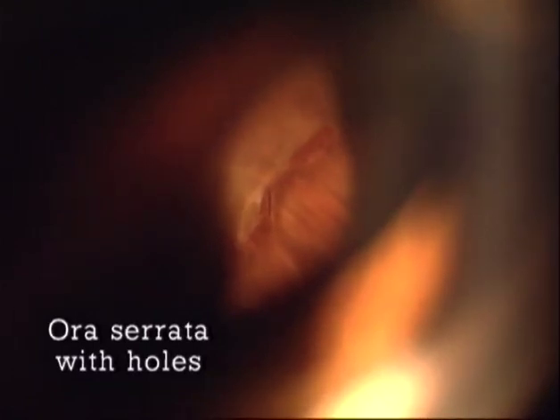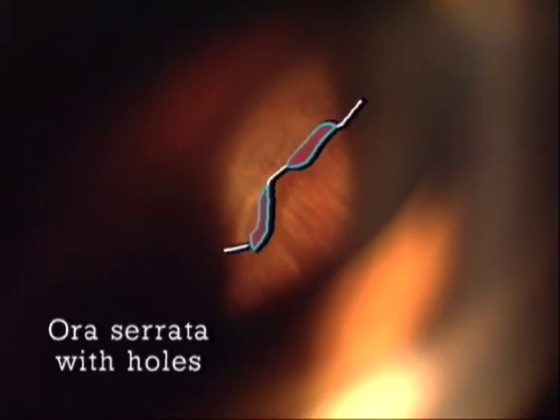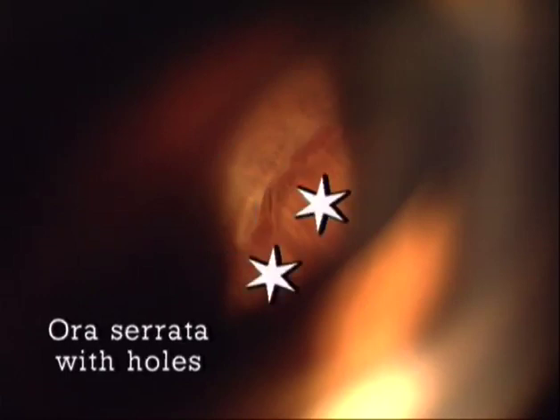When the scleral depressor is applied to the eye, the observer sees a protuberance in the mirror of the contact glass. On this protuberance, the ora serrata can be seen, and in the case shown here, even some small atrophic holes are observed. The area anterior to the ora serrata is the pars plana of the ciliary body.